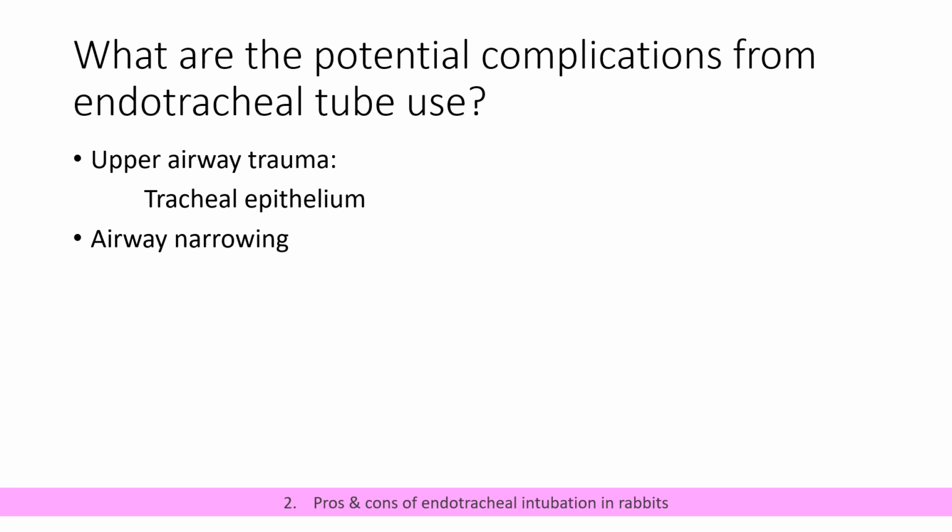And as you'll see, rabbits don't breathe under anaesthetic at the best of times. So that's something that you need to consider. And I would suggest if you're intubating rabbits, you need to be thinking about assisting ventilation, either with IPPV, with a rebreathing bag squeeze, or with a ventilator.